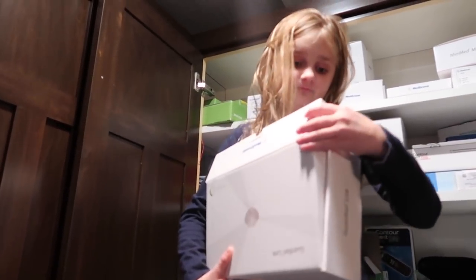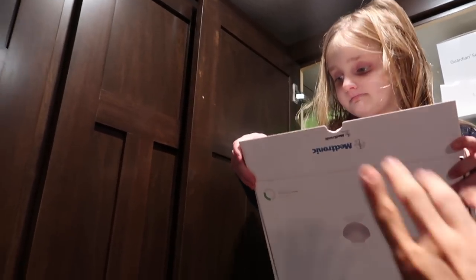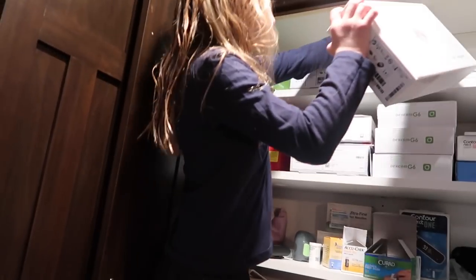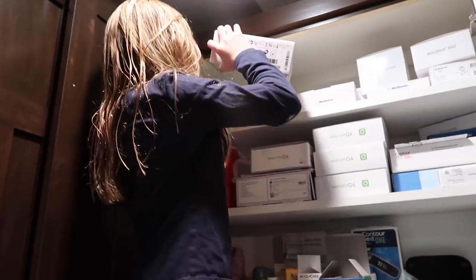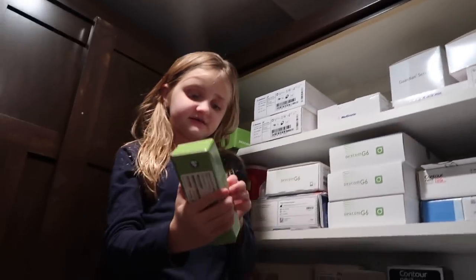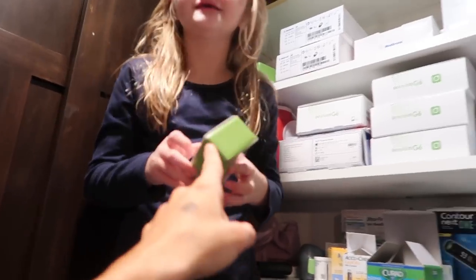We had extras left over. Some people don't know. So this is just leftover stuff that we are keeping there just in case. She can always have it for backup if we were to ever switch back.